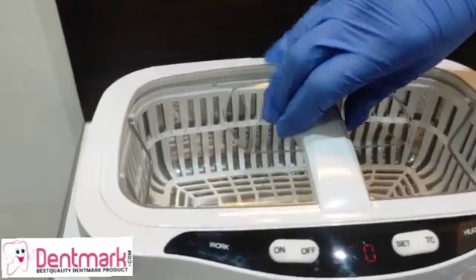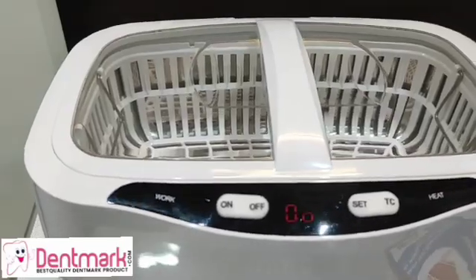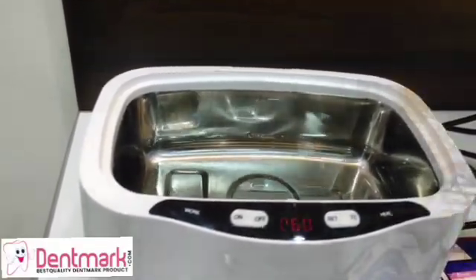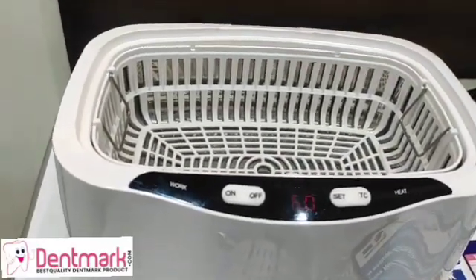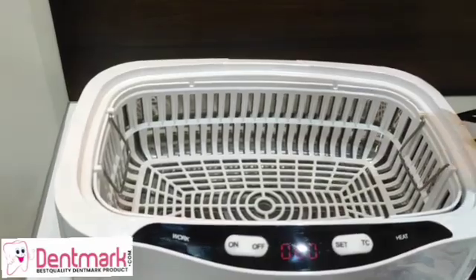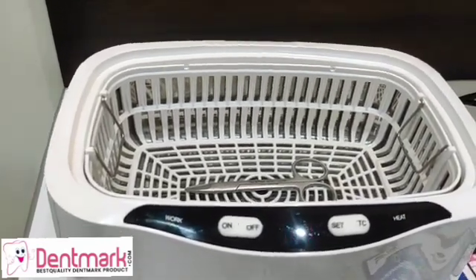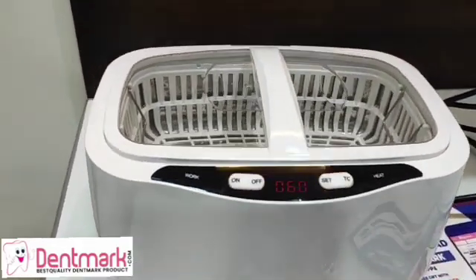Let's keep the basket in and flip back the handles to place the lid cover. Now let's put water in — the capacity is 2.5 liters. You can see the basket is now with water. You have to be careful that whatever instruments or tools you are sterilizing are completely immersed in water, so the water level should be checked properly.